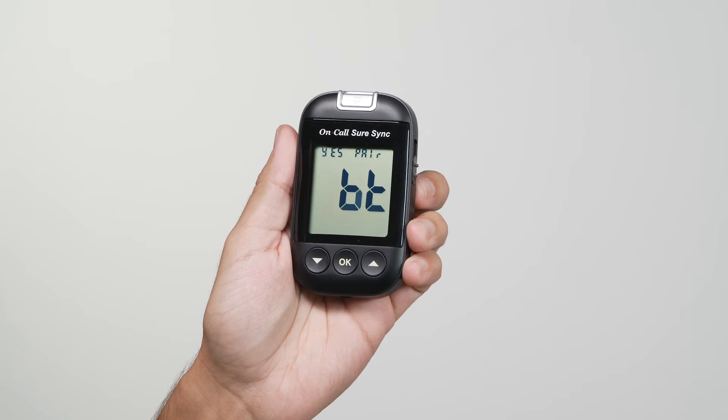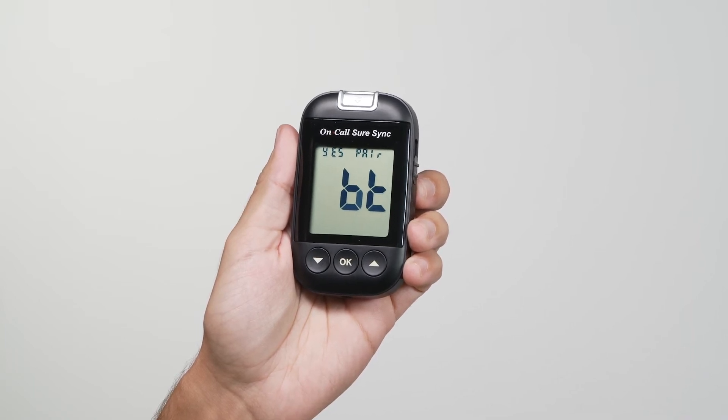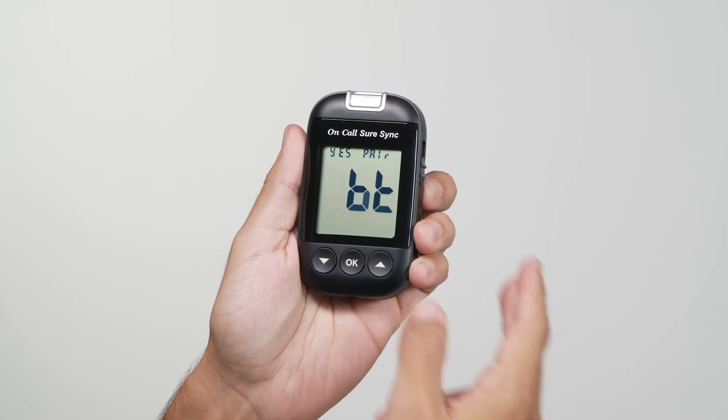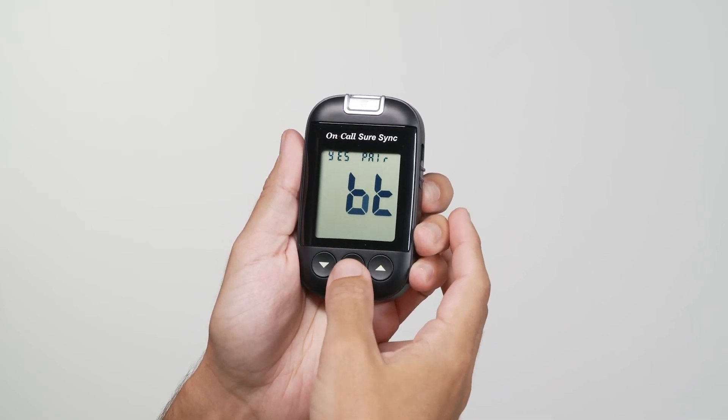From this setting, BT will appear on the screen with either yes or no and pair at the top of the display. Press the up arrow or down arrow button to change the setting.